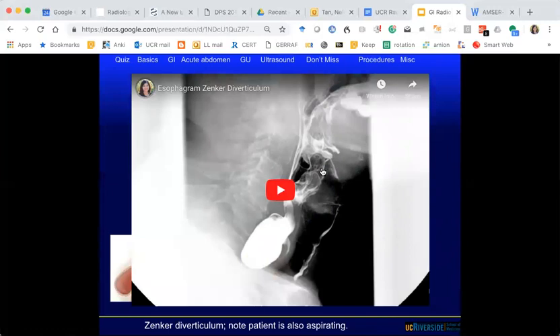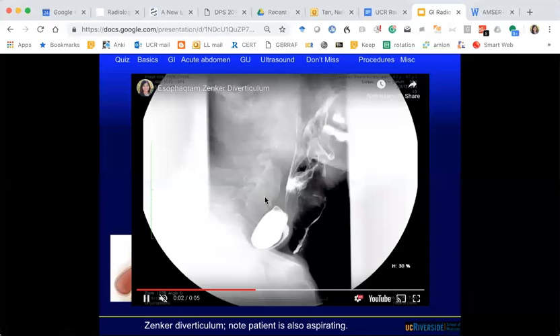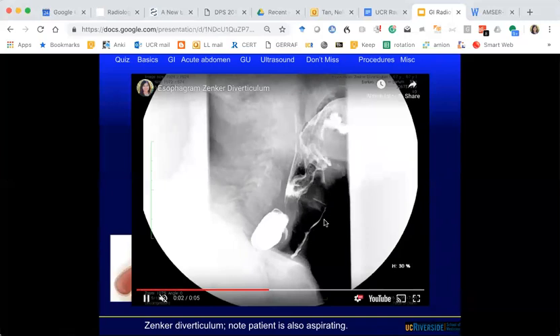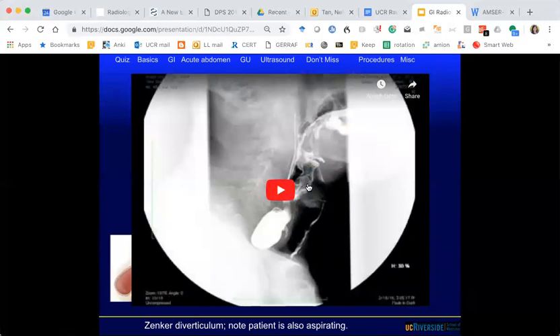Here we see a sac-like structure that is posterior — that's a Zenker's diverticulum. What else do we see? The patient is also aspirating — you can see contrast leaking anteriorly down the vocal cords and into the trachea. The Zenker's diverticulum can become symptomatic with halitosis, depending on severity and size.